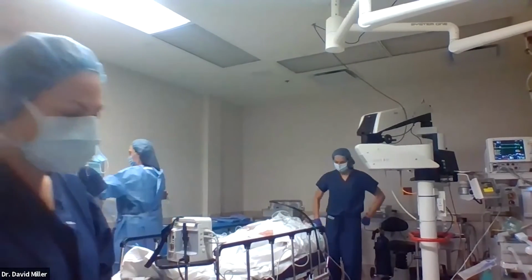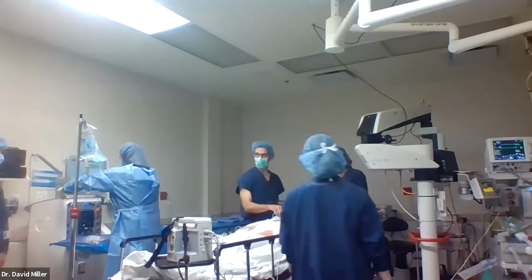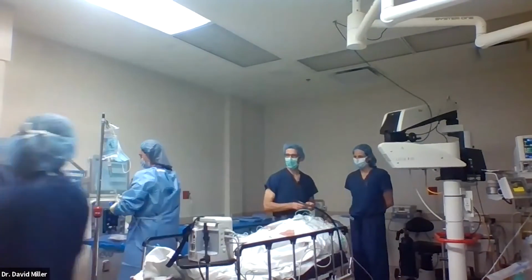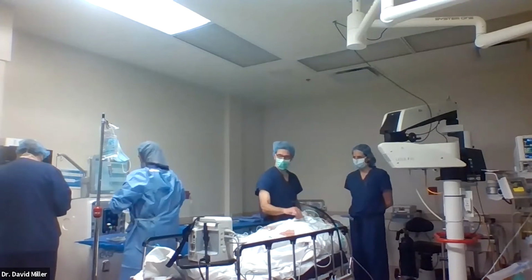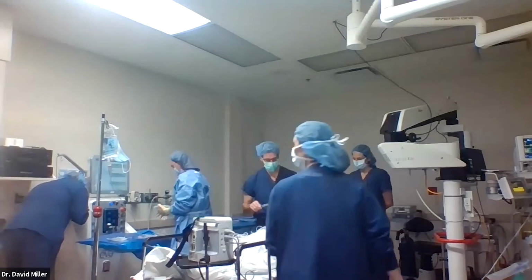Okay, John, how you doing? Dr. Miller here. We'll do our timeout, okay, working on the right eye. Julia's getting it written on the board for us with John's name. And we're doing a vitrectomy for retinal detachment repair, right eye.